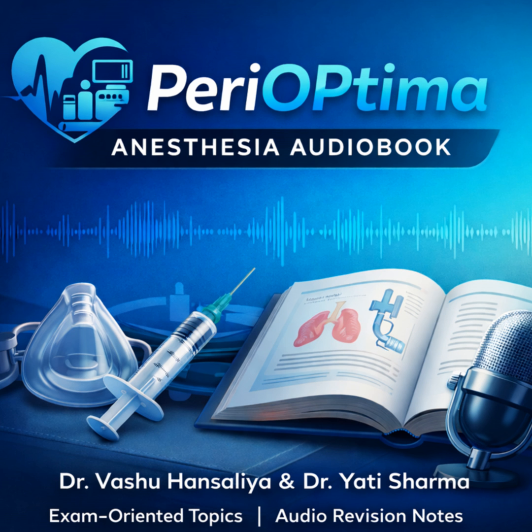And the physiological benefit of this working correctly is what our sources call the oxygen reserve. This is such a great piece of integration for the exam. By increasing the FiO2, you create a massive reserve. Think about it. An adult's functional residual capacity, the FRC, is about 3 liters. If you're breathing room air, the oxygen store in that FRC is maybe 500 milliliters. That's a very short time of safe apnea. But if the machine safety systems have kept the FiO2 high, say close to 100%, you can fill that whole FRC with oxygen. You can boost the oxygen stores in that 3-liter FRC to nearly 3 liters of pure oxygen.